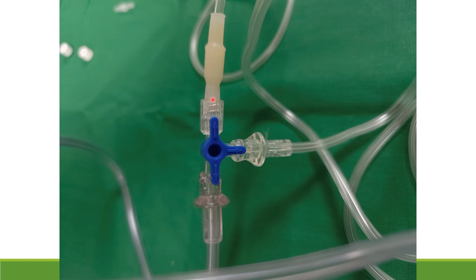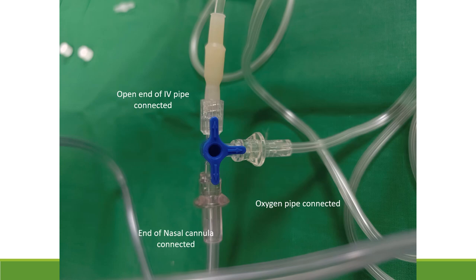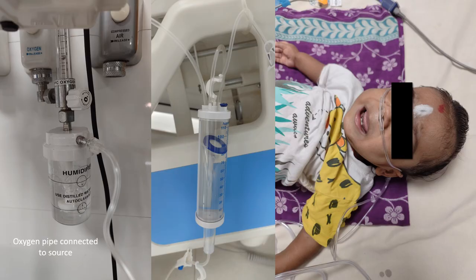The three-way stopcock is now connected: one end to the open end of the IV pipe, another end to the oxygen pipe, and another end to the appropriate-size nasal cannula. Attach the other end of the oxygen pipe to the central oxygen supply and keep a flow of at least four to six liters per minute.